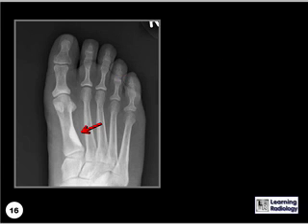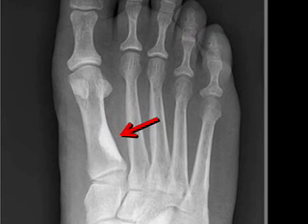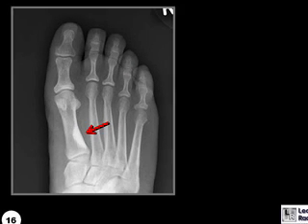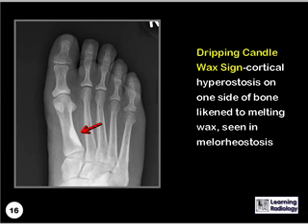What sign is demonstrated here? The dripping candle wax sign, which is cortical hyperostosis, usually on one side of the bone, which was likened to melting wax, seen in melorheostosis.